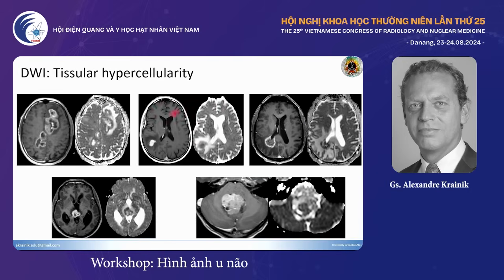And here are some illustrations. You see, here's this large multifocal midline tumor. It was a diffuse midline glioma, actually a glioblastoma. Anyway, all those diffuse midline gliomas are now considered highly malignant, grade 4, even if they are not enhanced. Then here you see the border of some of the lesion with a decreased ADC.